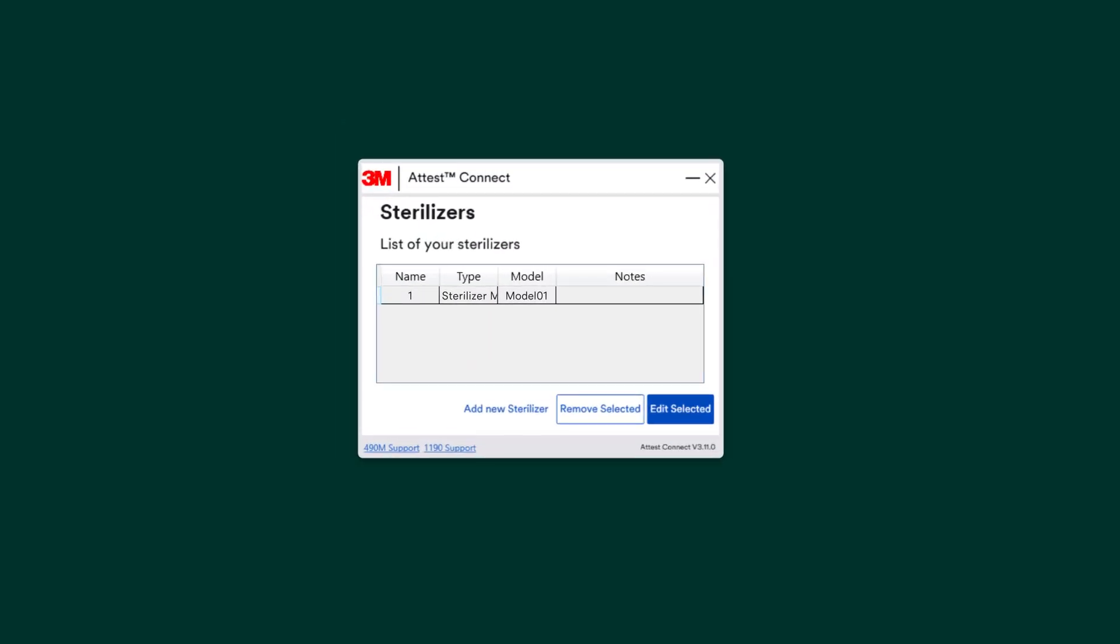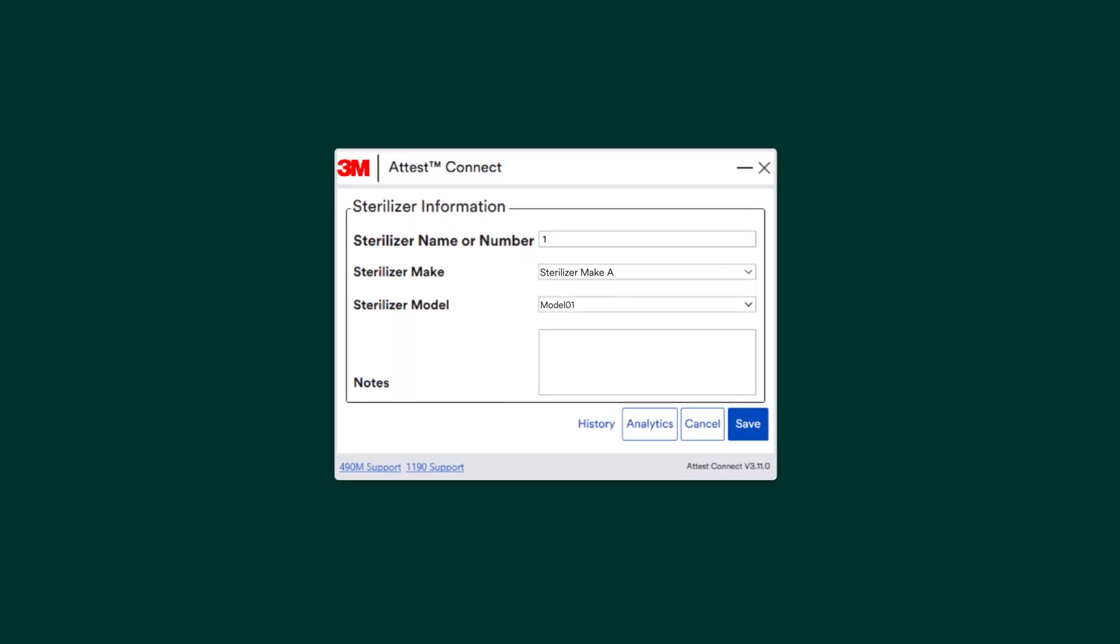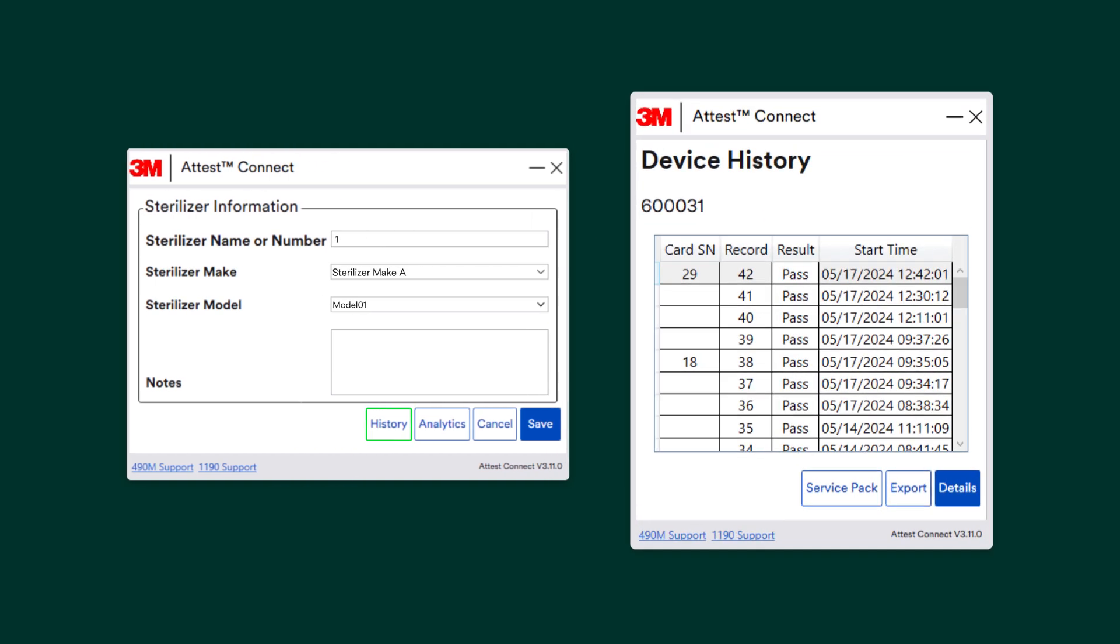To edit your sterilizer's information, highlight the sterilizer and click on the Edit Selected button. This will allow you to make any changes you need. You can also get a summary of test card results for that sterilizer by clicking on the History button in this window.